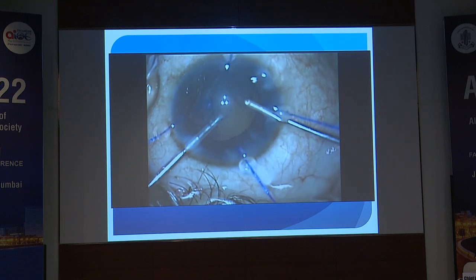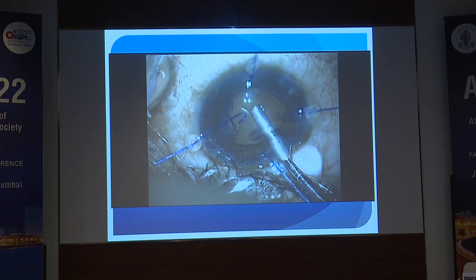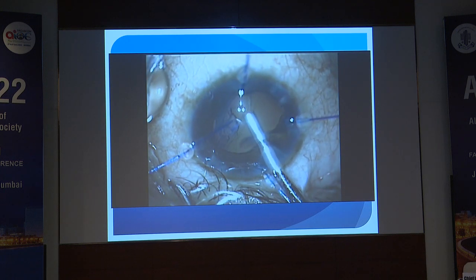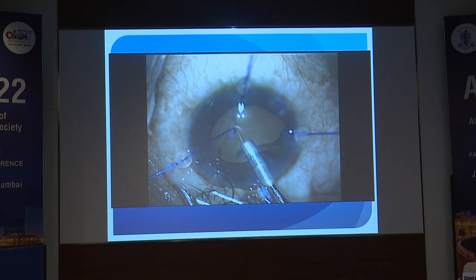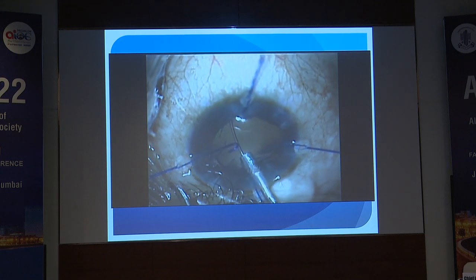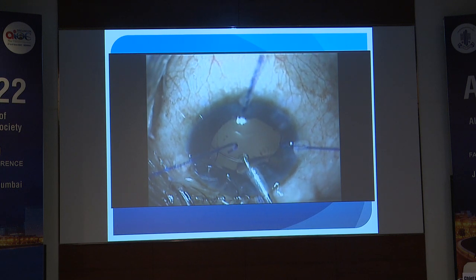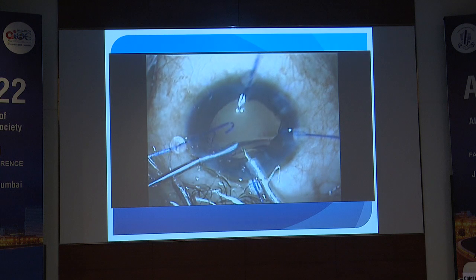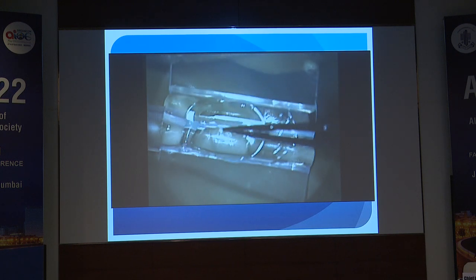And the easy way of handling it is simply to push in the ring on one side, usually from the opposite direction from the area where the main rhexis is. Let it fall back into place. And then inject your lens on top of it.